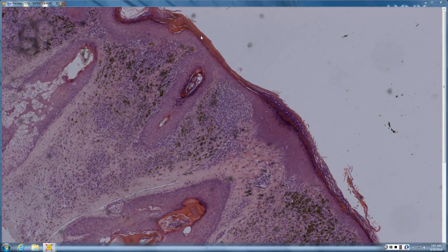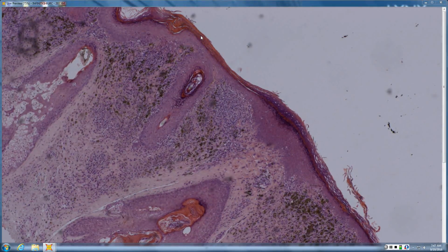Lichenoid regression of melanoma tends to be a broad biopsy, with effacement of the rete in sun-damaged skin. Everything's very flat. This is a bump with the nevus. So you're absolutely right, I think the two are unrelated processes. You've got the nevus there and the lichenoid infiltrate, but probably not lichenoid regression of melanoma.